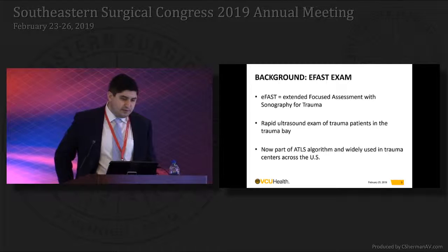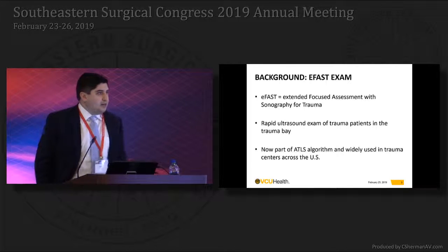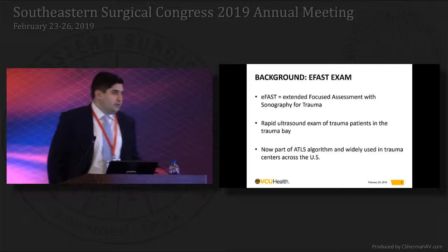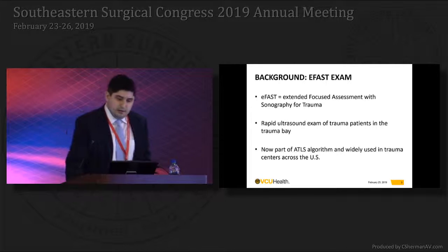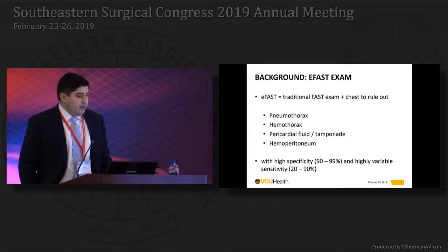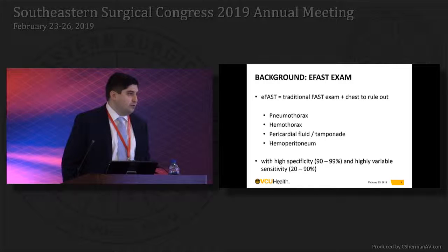So EFAST stands for Extended Focused Assessment with Sonography for Trauma. It's a very common test done in trauma bays across the country to assess for injuries that can lead to rapid deterioration of patients. It's now replaced diagnostic peritoneal lavage in the ATLS algorithm. So our EFAST is our traditional FAST exam with the abdominal windows plus the addition of 2 thoracic windows to assess for pneumothorax and hemothorax.